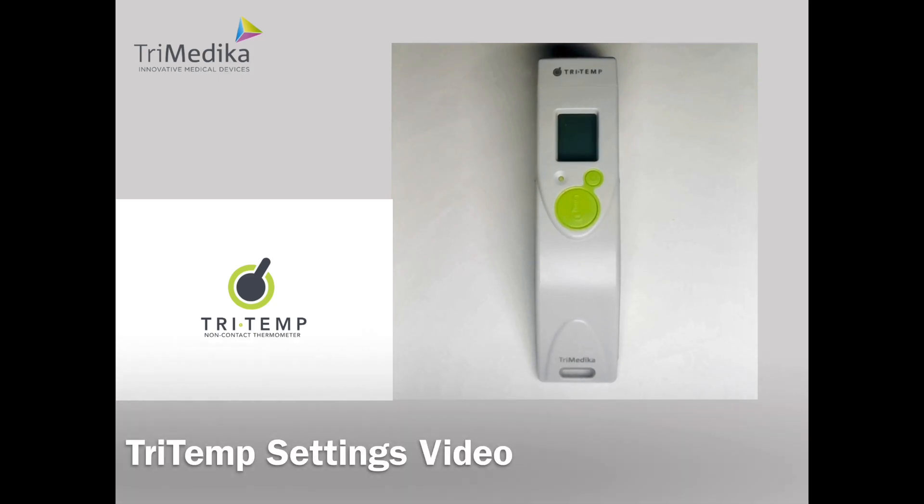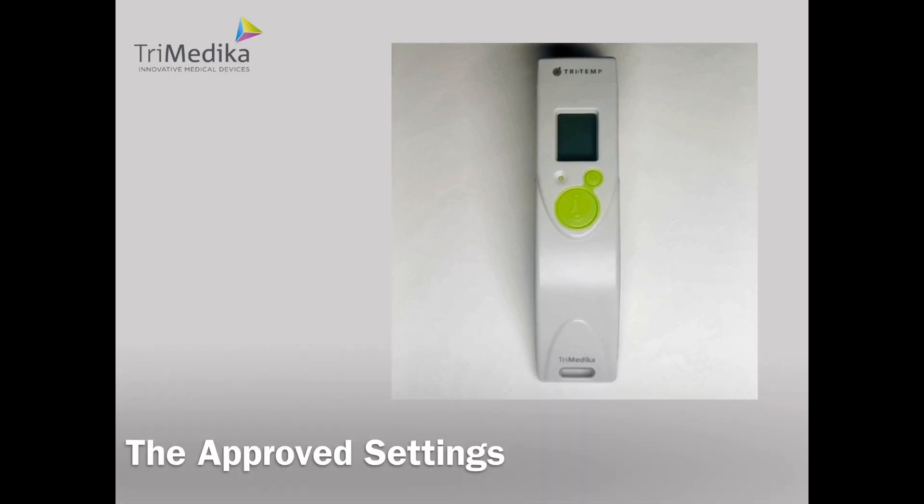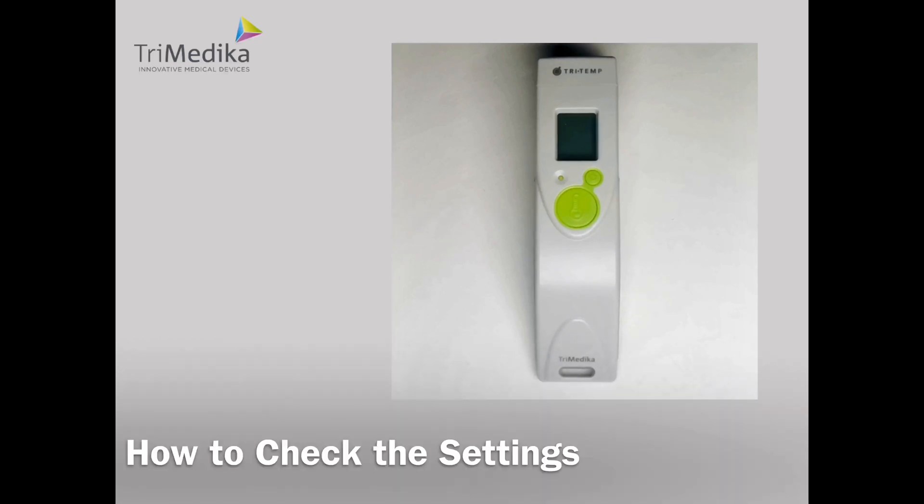Here is the Tritemp non-contact thermometer from Trimedica. In this video I will show you the approved settings, how to check the settings and how to change the settings.